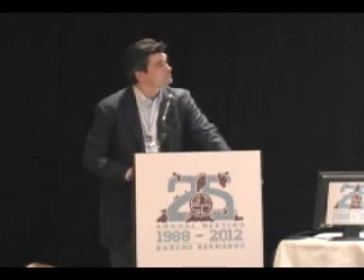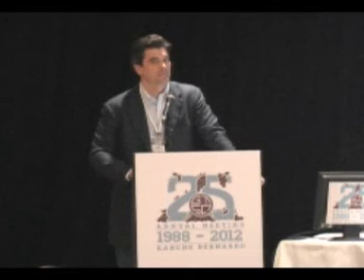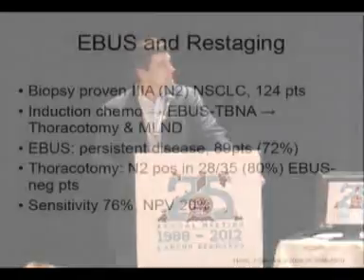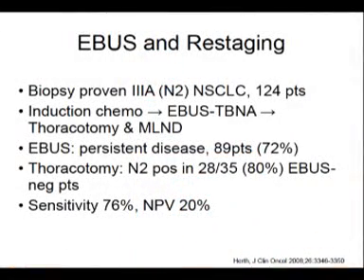Next, please. How about restaging? Oftentimes we'll diagnose 3A disease with an EBUS. Is it any good for restaging? One study has looked at this. Again, from the Heidelberg group, they took 124 patients. They gave them all induction chemotherapy, then subsequently performed EBUS on all of them. Those that were EBUS negative then underwent thoracotomy and mediastinal lymph node dissection.